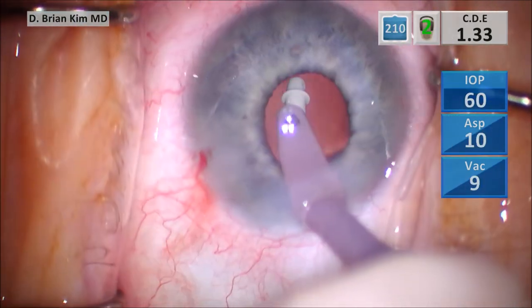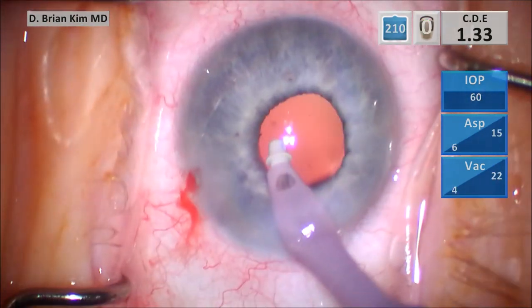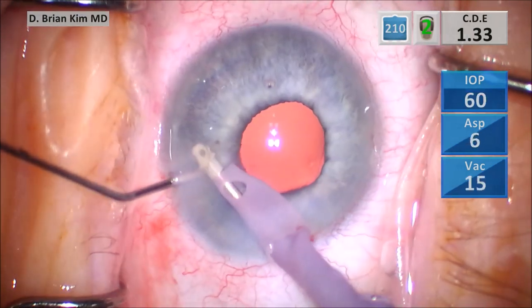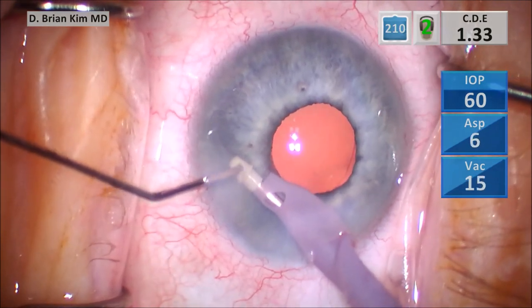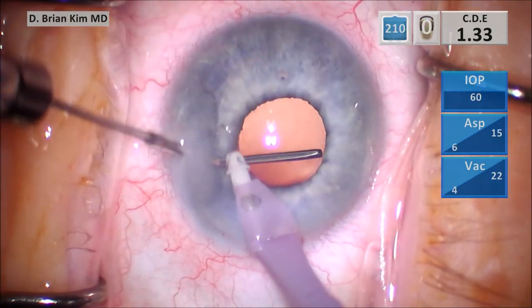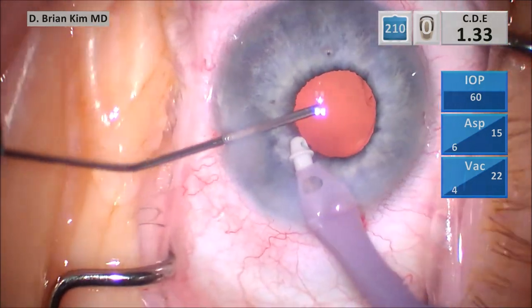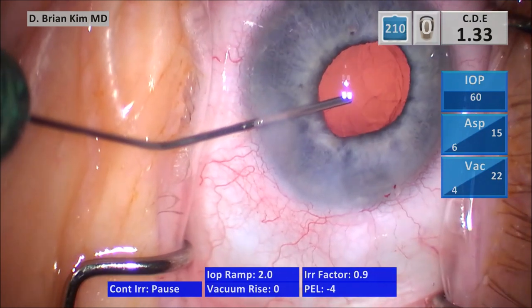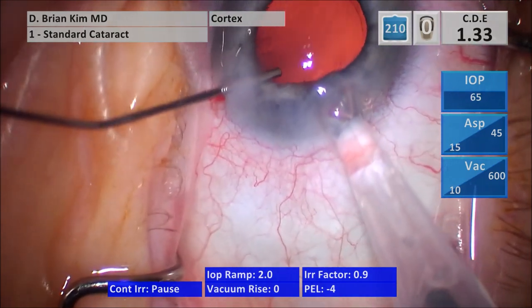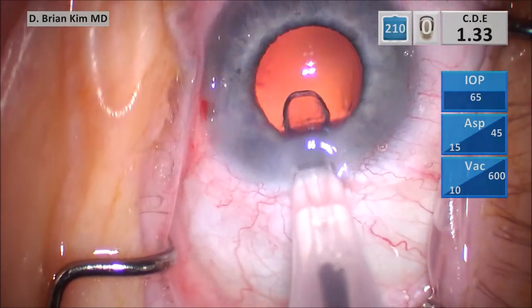I switched to polish mode here because the visibility is poor underneath the anterior capsule, and because of this very floppy iris I like to go straight to polish mode. I don't want to accidentally grab the capsule as I'm going underneath it, because grabbing the capsule can grab the zonules, and with poor visibility this is not a good technique. I'm pushing BSS and pulsing some BSS into the capsular fornix to check for any dust bunnies — I didn't have any here. I inject some cohesive viscoelastic to open up the bag and the pupil. I don't like sweeping in this case either, because with poor visibility I might cause more iris trauma or damage the capsule or the zonules.